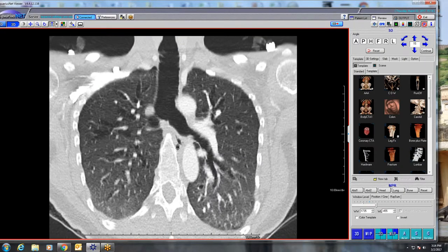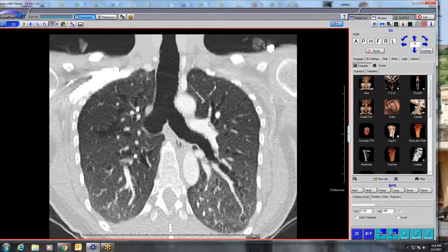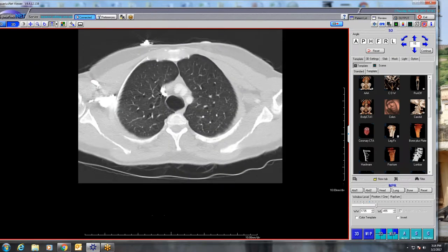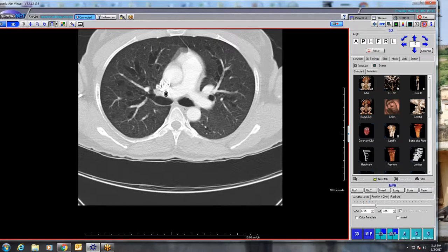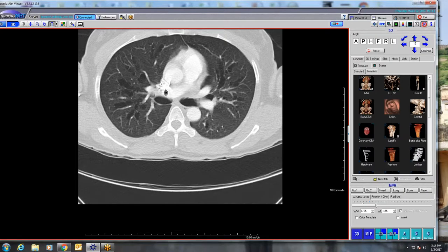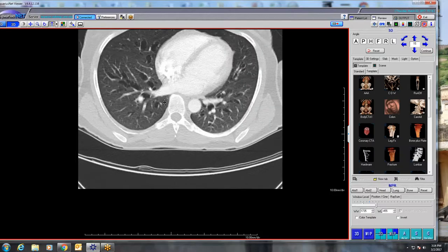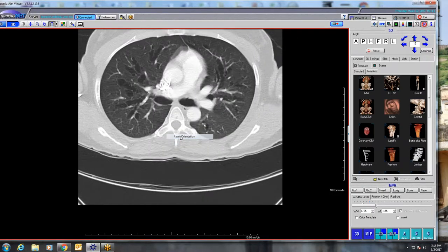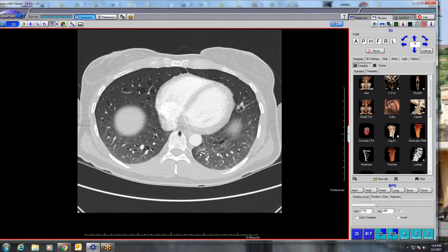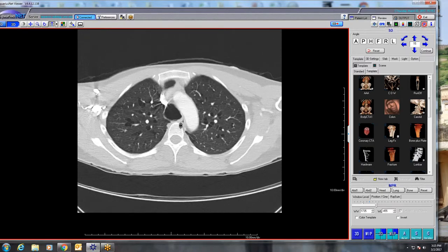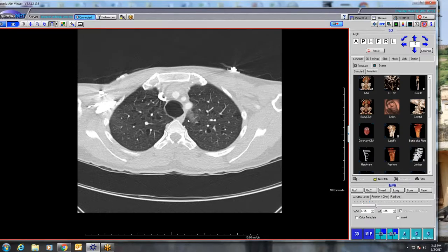I'm really impressed by the extent to which the bronchi are dilated. But if you look for a bronchial wall between the lumen and parenchyma, you don't see anything — they're not thickened at all, imperceptible. The bronchial walls are super thin. This could be some other entity. I wonder if she has some weird entity where the elastin of structures just melts away and dilates — the walls get very thin and dilate. The primary deficiency in Mounier-Kuhn is that the elastic fibers are defective, leading to dilation.